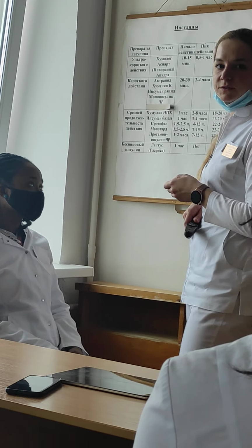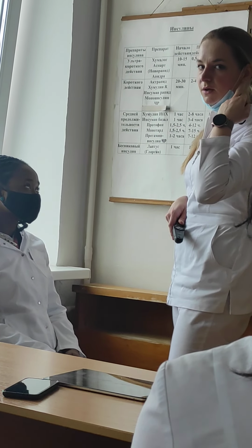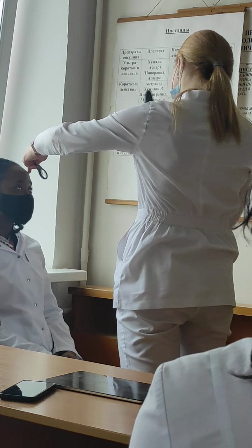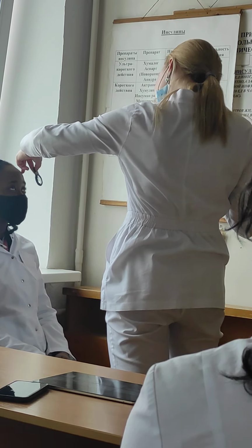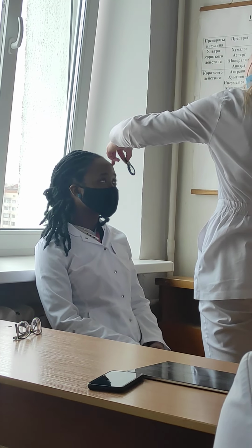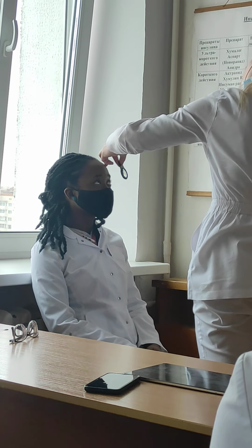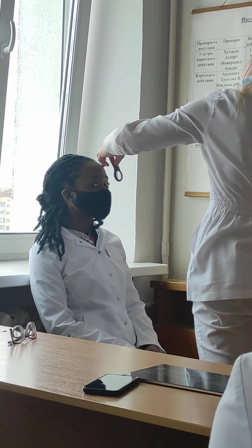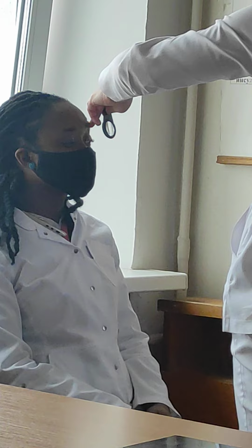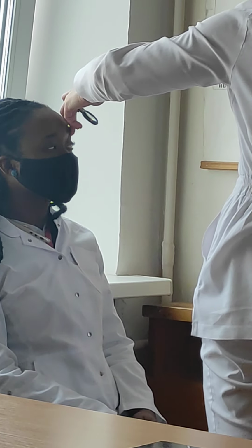To see the optic nerve disc head of the left eye, we need to ask the patient to look at our ear, or earring if you have one. So please look over here, and do the same: having the red reflex and seeing the optic nerve and the vessels. I will ask him to look up, to the right, down, and straight to the right.